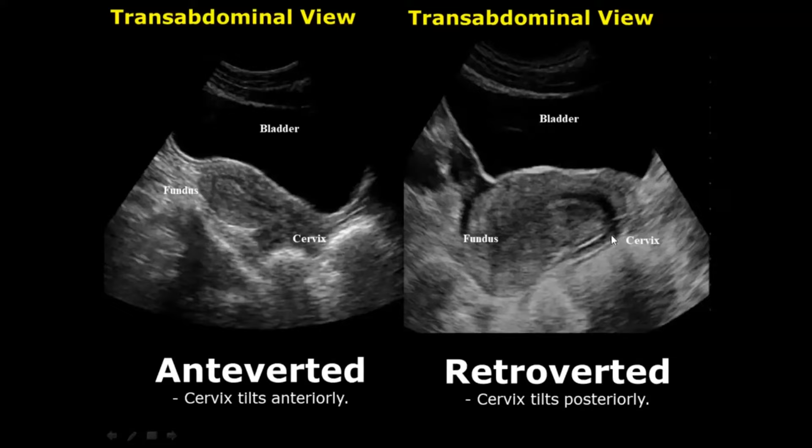On the right side is the retroverted uterus. Here you can notice the cervix is facing posteriorly or downwards. Again, there is no noticeable bend of the body of the uterus, so we do not comment on it.